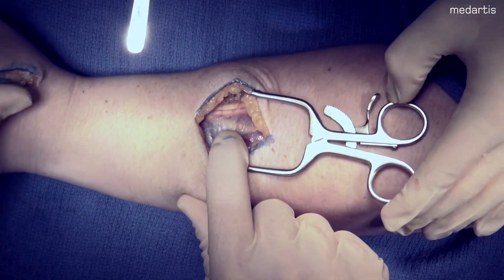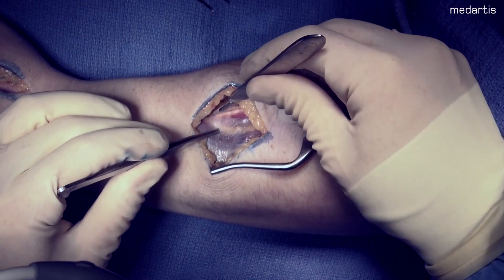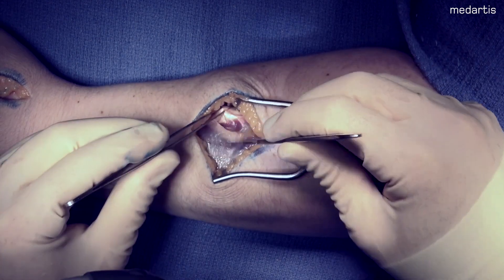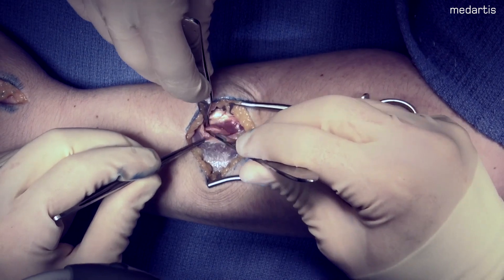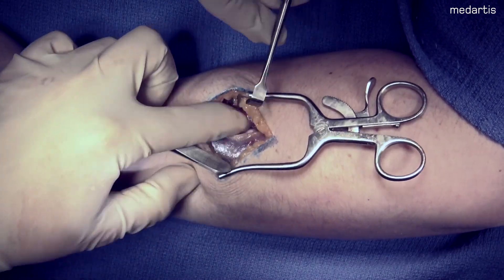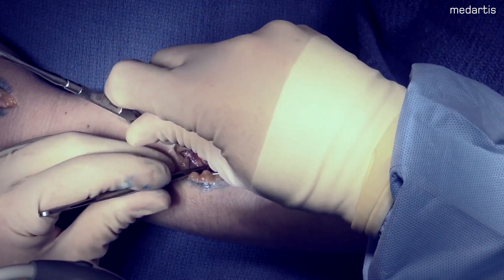After incising through skin, we're going to identify our fascia and release that. Our proximal window is between the brachioradialis tendon and the second dorsal compartment. You can see as I lightly pull on the brachioradialis tendon it radially deviates the wrist; as I pull on the ECRL it extends the wrist. Special attention is needed for the superficial radial nerve. Once our window is made and we are on bone, we begin to dilate from proximal to distal to prepare for placement of our plate.